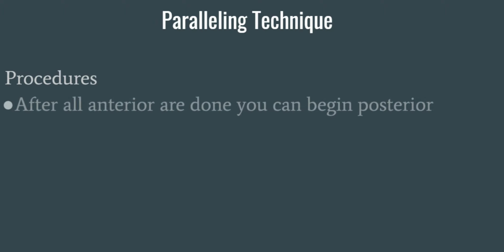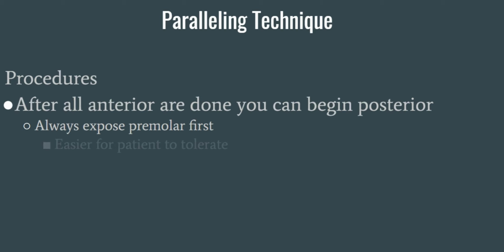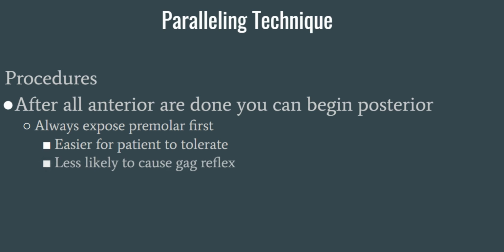Once the anterior are completed, you can begin the posterior exposures. It's recommended to always expose the premolar first. Again, it's just easier for the patient to tolerate. It's less likely to cause the gag reflex, and it helps them get used to having that in the back of their mouth.